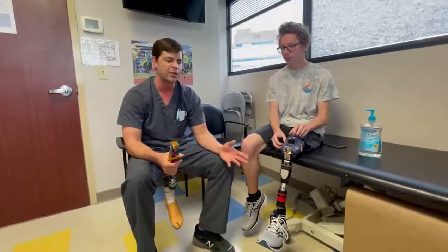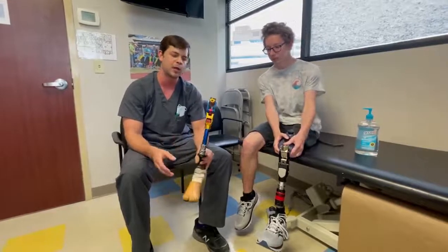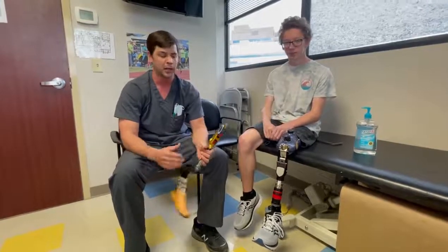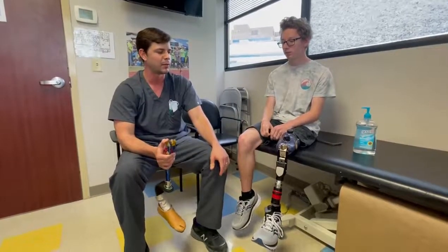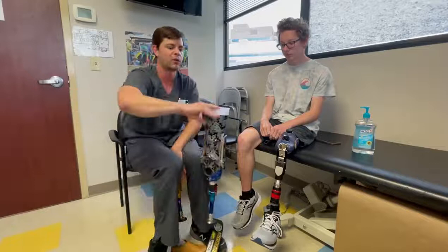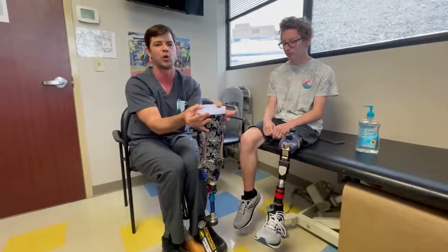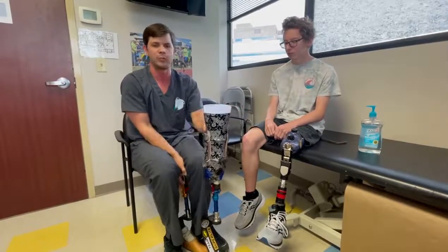Justin notes that everyone loves lightweight knees and prosthetics, but for safety, activity level, and Aiden's growing body weight, transitioning to adult components was the right call — that's why he came in this past week. He's had the new setup for two to three days and has been coming back regularly. They lowered the carbon frame a little in the perineal area where he was getting pressure, which allows the frame to flare out more. The flexible inner will also flare out on its own with use, or a heat gun can accelerate that.